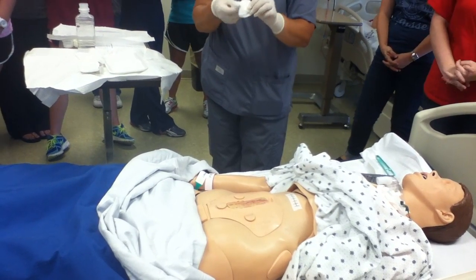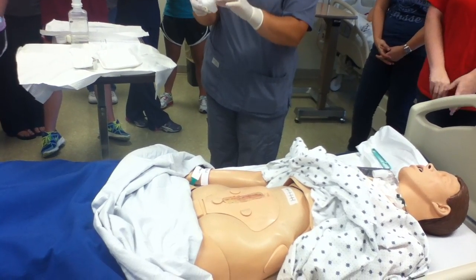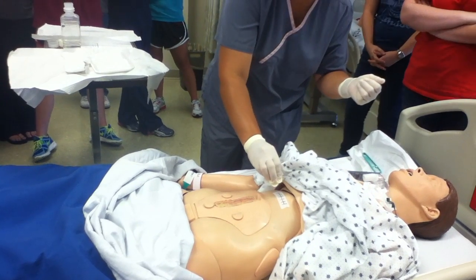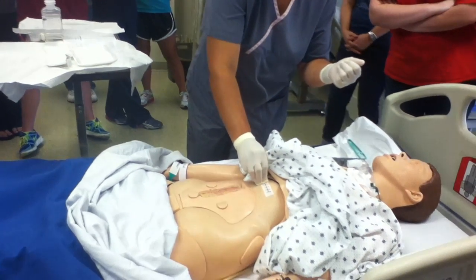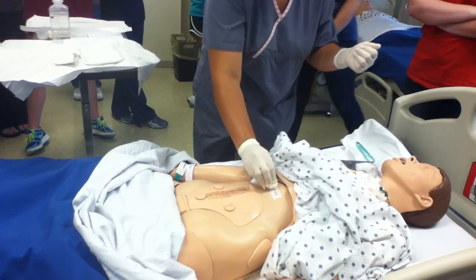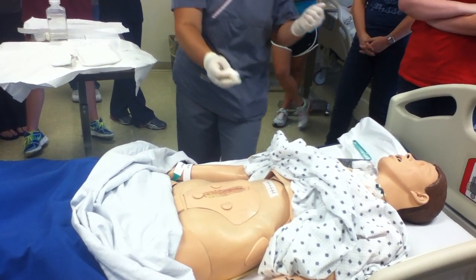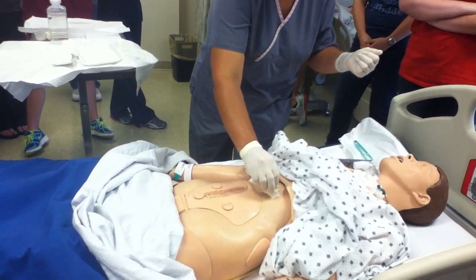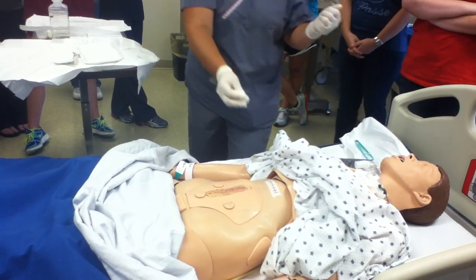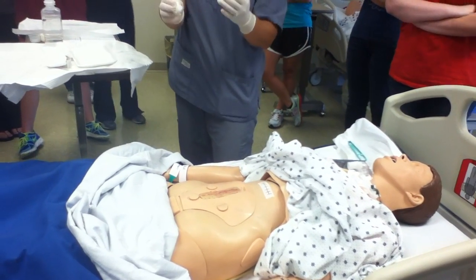Now, if you're good, you can take and turn it and use different edges, but that takes a little bit of practice. So what you would do is you would actually start in the center of the suture line, and you would wipe out, throw it away, and get another one. Then I'm going to go out from here, throw it away, get another one. Start at the center, work my way out the first staple, throw it away, get another. Same thing, you're always going from the center, you never cross the center.